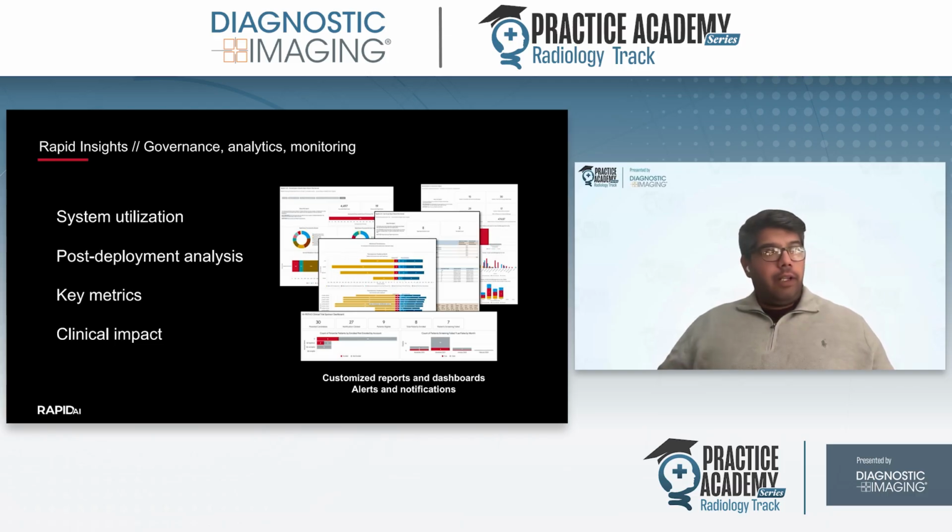And these are regular metrics for the system. And what's really cool is that Rapid monitors it, and there's actually an alert setup that goes out both through the Rapid and to us if something does go wrong. And I think that really helps figure out if there are any upcoming issues, to really tackle them head on before they become bigger.